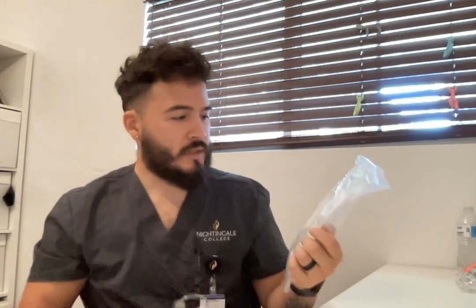The things we're going to be using today are our gloves, obviously, an alcohol wipe to clean the IV port, the Y port. We're going to be using this 92-inch gravity set. This is going to be our primary. And then our secondary set, and it's this one right here.